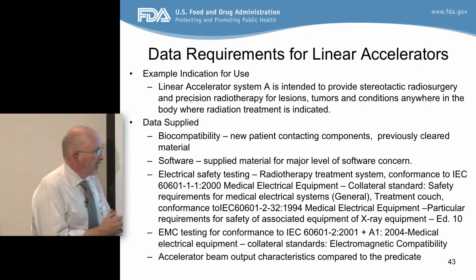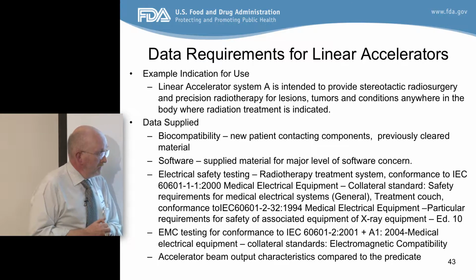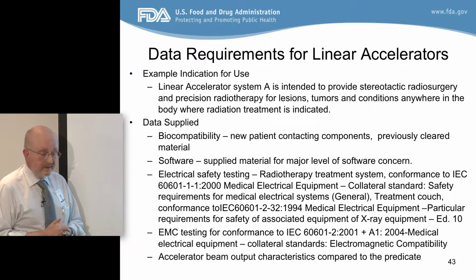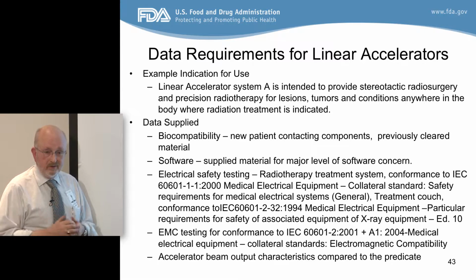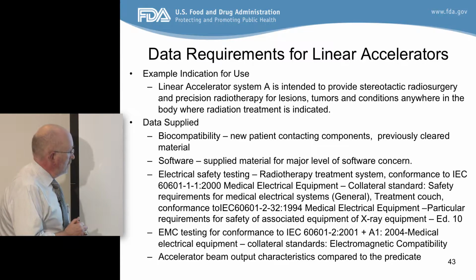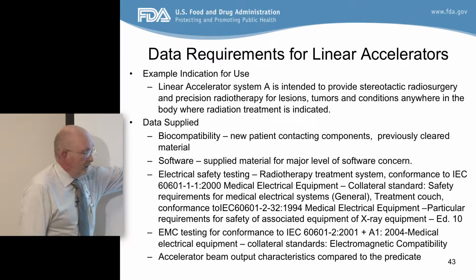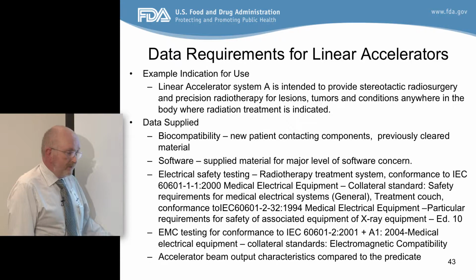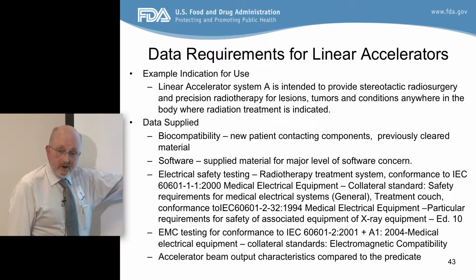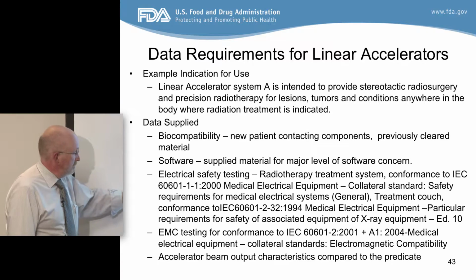But when we review linear accelerators, for example, we do ask for a lot of information, as some of you already know in this room. Biocompatibility is one thing that we have a tendency to go after. Software, we're always looking at software changes.